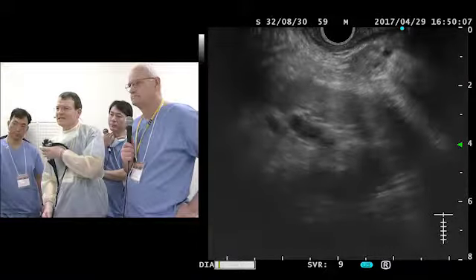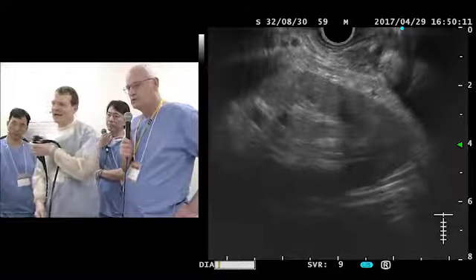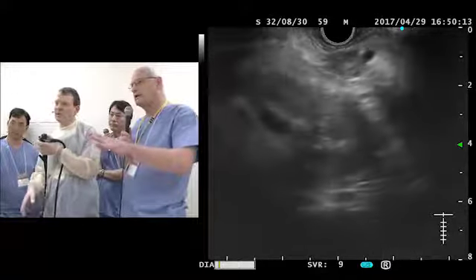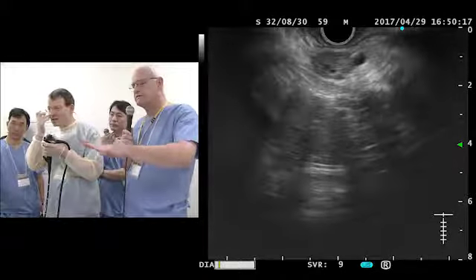Dr. Seewald, we'll go to Dr. Saito's rectally. Okay, but sorry, we- Dr. Toyonaga's is off. Can we just summarize the case?